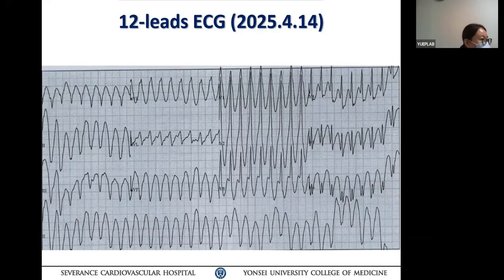Ventricular tachycardia. Ventricular tachycardia? Yes. From where? Left side. So left ventricle, what do you say? Left ventricle and left superior side. Upper superior side. No, it's coming from apex to the base. There, I have three options: inferior mitral valve and left posterior fascicle. The last one I forgot.